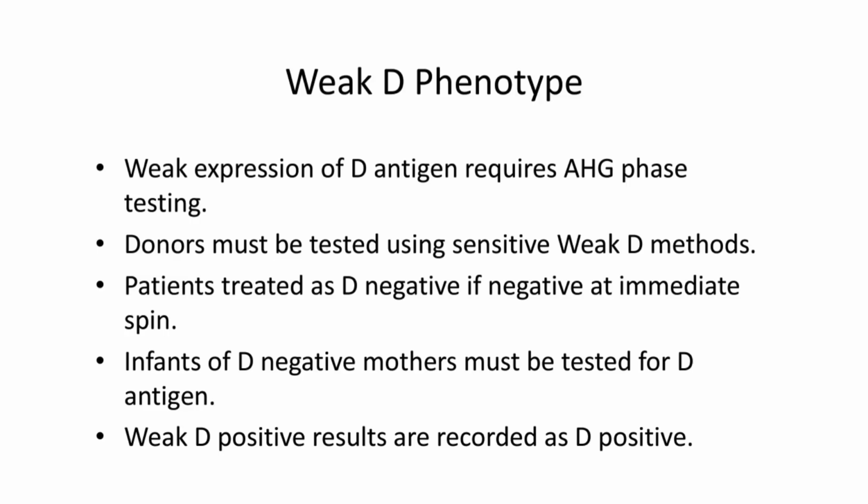All infants born to D negative mothers must be tested for the D antigen to assess risk for hemolytic disease of the newborn. Any result that is weak D positive should be recorded as D positive.